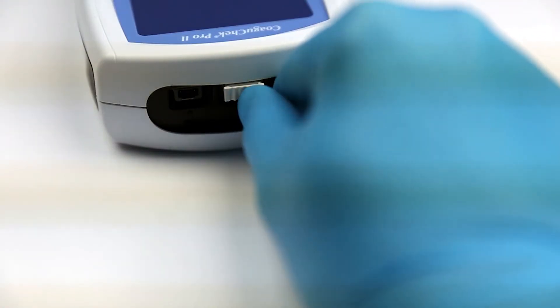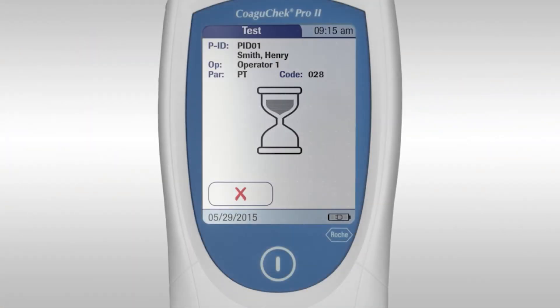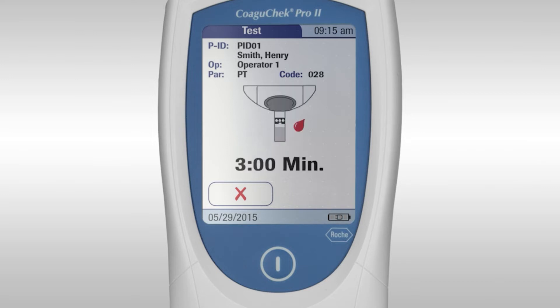Insert the code chip into the code chip slot until you feel it click into place. The hourglass symbol indicates the meter is warming up the strip. Only apply the sample when you see the blood drop symbol appear. You must apply the sample within three minutes.